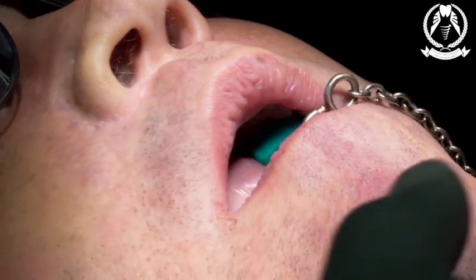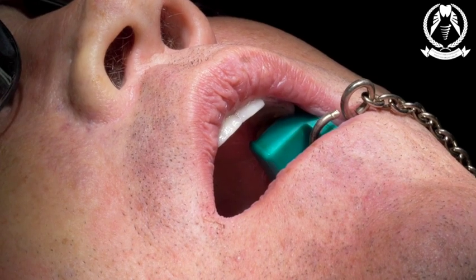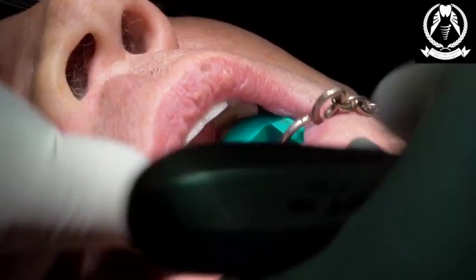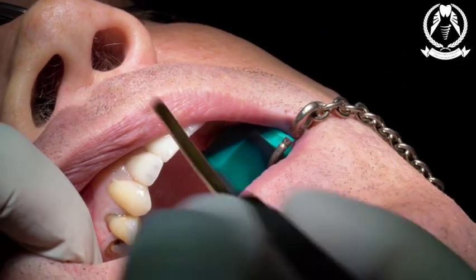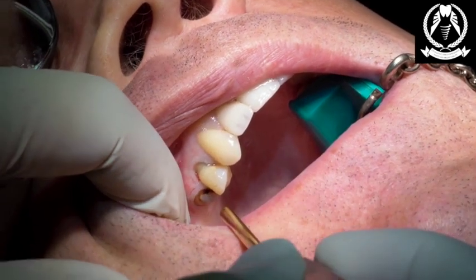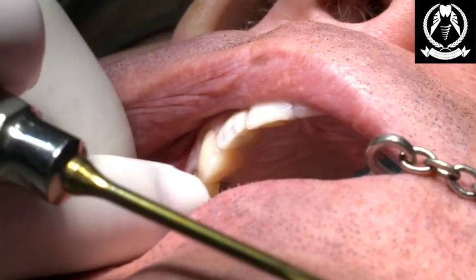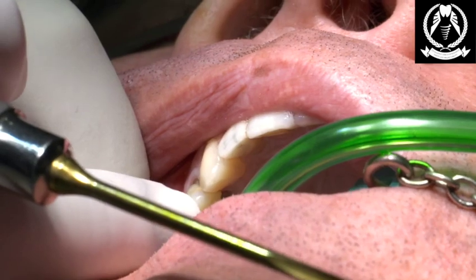Thank you. Alan, how are you doing? Very well. Great. Okay, so this is Alan, our patient for today, who's having some implants with me, and we're just doing some extractions on the top right of some retained roots and some teeth which have inadequate coronal structure. So Alan's under very mild sedation and we can talk to him. So you okay, Alan?